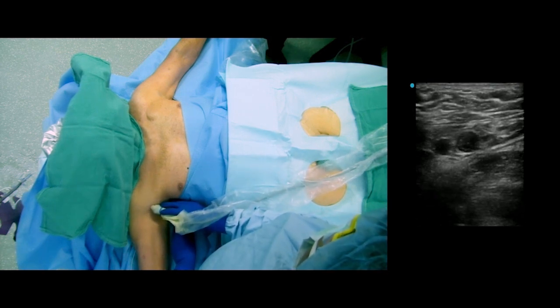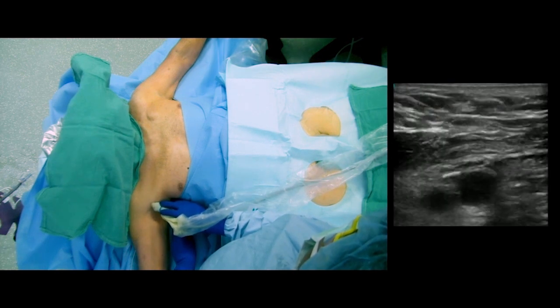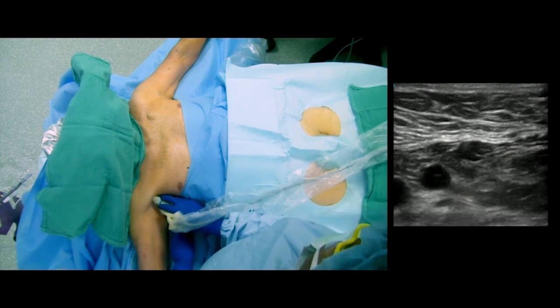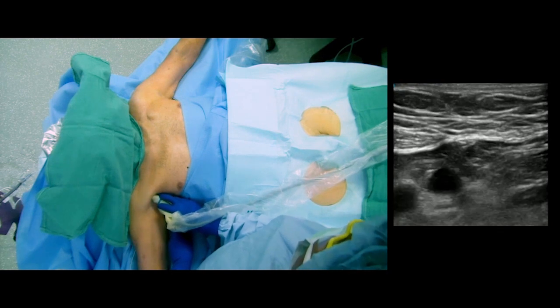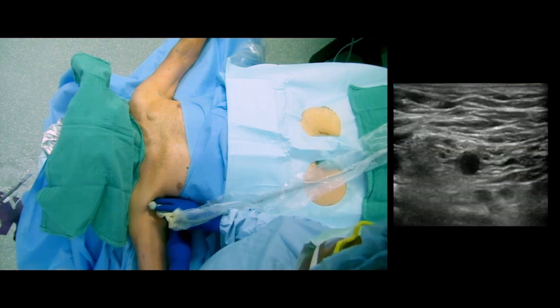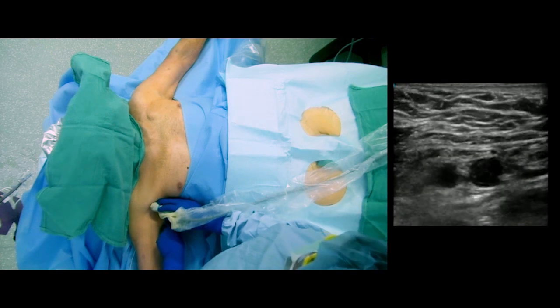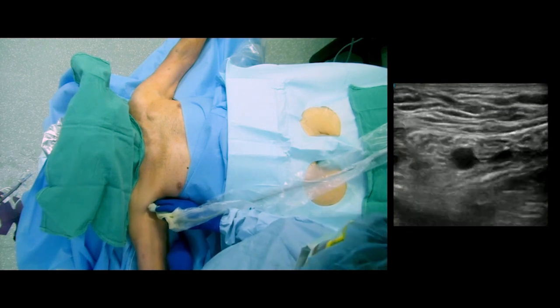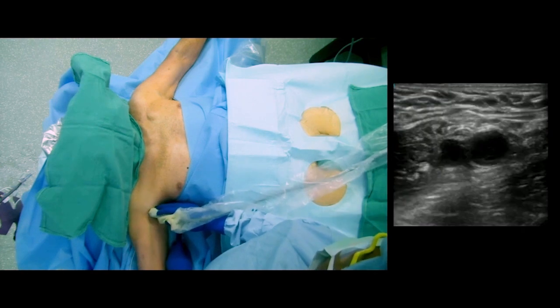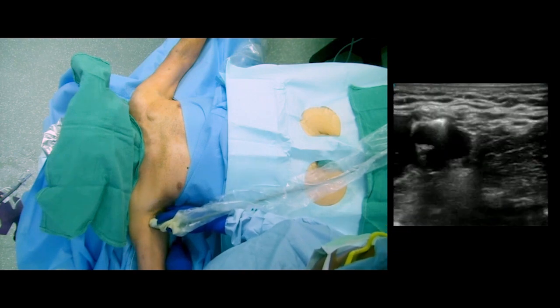Here you can see our access is fairly high up, with relatively slow flow in the compressible vein. We use ultrasound for access essentially for every case. We put a 5 French sheath in whatever we feel is the most easily accessible portion of the vein. We always use a micropuncture kit to gain access so that even in an anticoagulated patient, we can avoid sticking the artery and do this very safely.